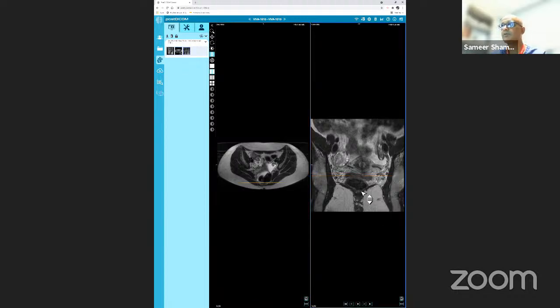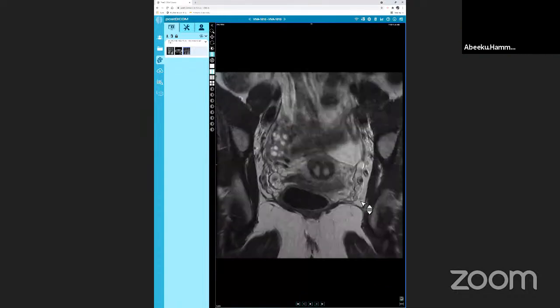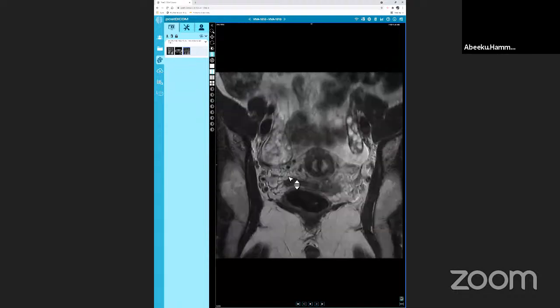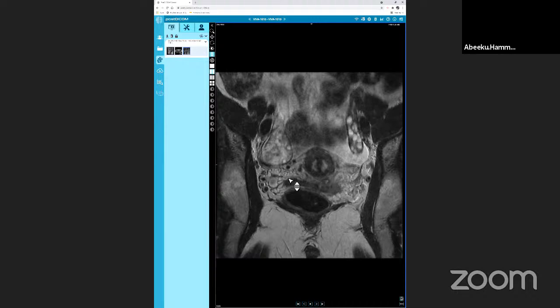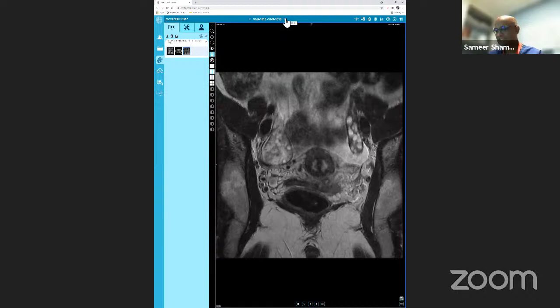So what's happening with the ovaries here? It's longitudinally oriented, high riding. It's polycystic in nature on the right side. The left side is also polycystic in nature. It looks like she is on the upper side of weight, looking at the soft tissue. So this can be a polycystic ovarian disease. I'll correlate with the blood markers and then look at the clinical history for any history of hirsutism, and possibly refer to the GYN doctors MDT for discussion. Okay, good. Let's move on to the next case.